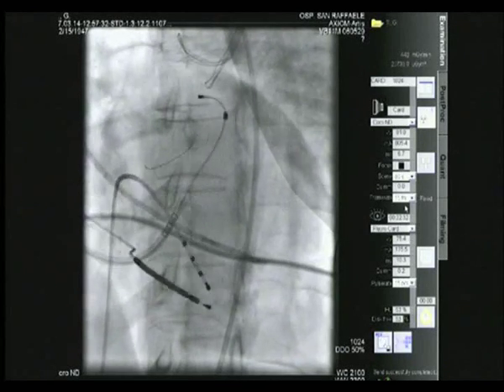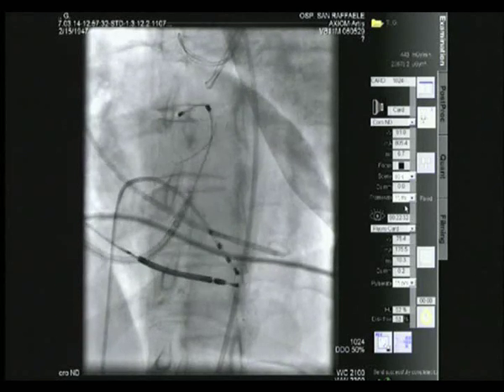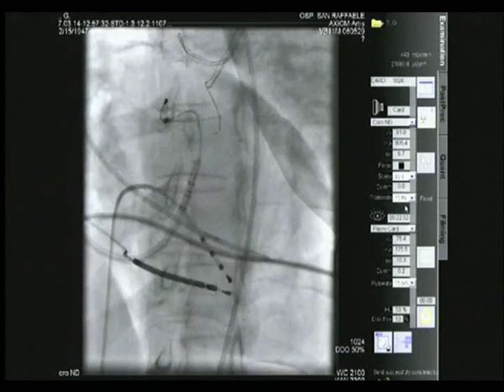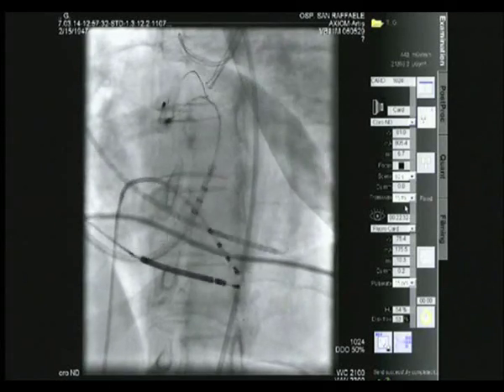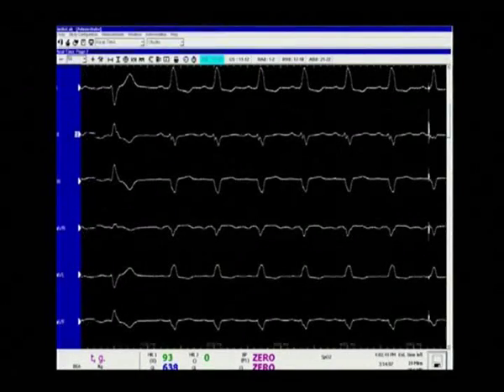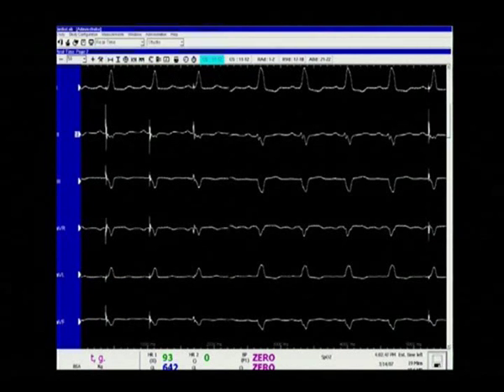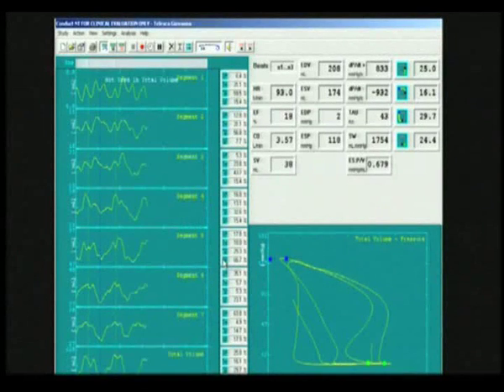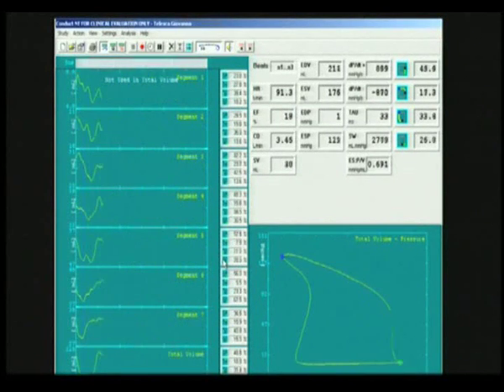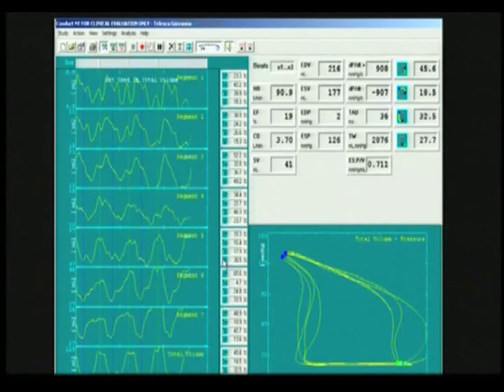Once the guide wire has reached the desired target, we push the lead over the wire until we reach the guide wire's tip positioned in the anterior branch. The ECG pattern doesn't differ greatly before and during pacing at this site; the only difference is a slight shortening of the QRS complex. The left panels showing sequential volume channels from apex to base along the axis of the conductance catheter are not aligned as when pacing from the lateral branch, which results in no improvement of systolic and diastolic hemodynamic parameters.